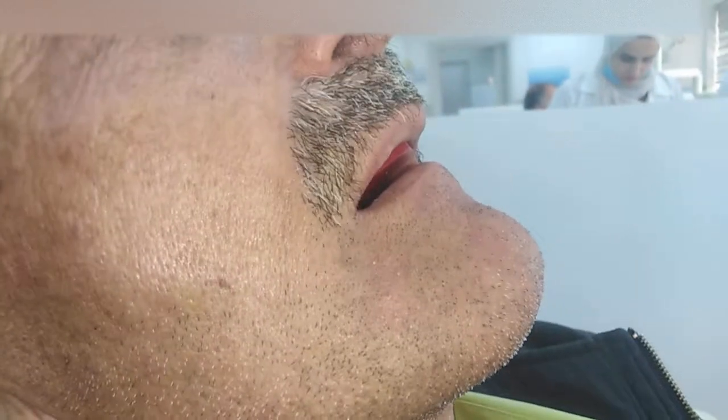This is a case where the student says she has enough labial fullness, but I'm going to concentrate here about the difference between the active lip and the flabby lip. The lip consists of two parts: the muscular part that's inside, and the flabby tissue that is present on the outside.